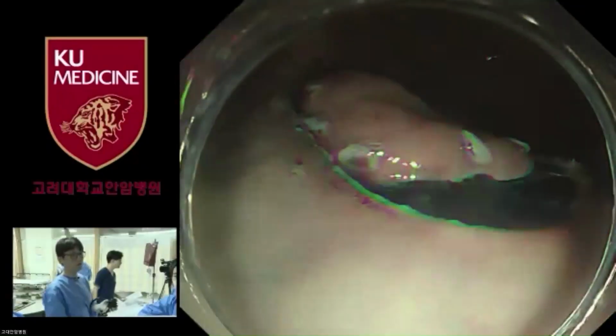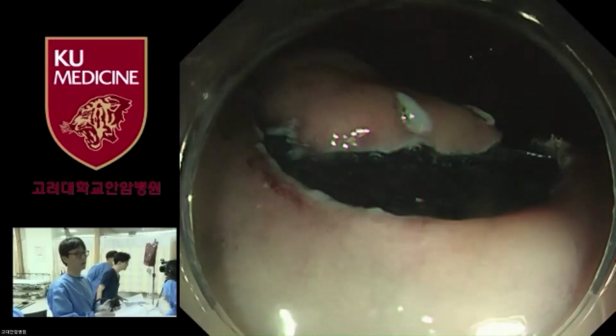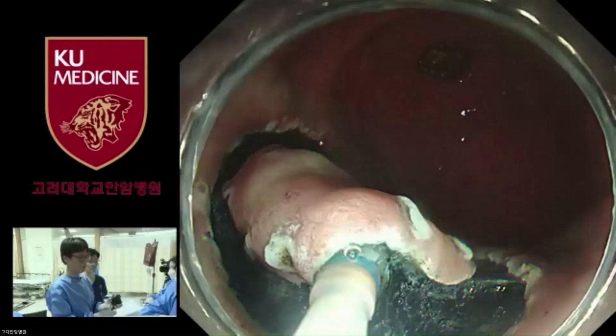Endocut I effect 2. And for Swift, what effect? You mean for the Swift coagulation? Usually for Swift coagulation we use effect 4, and the power is 50 watts. Yeah, it's the same. Ricardo as well, same setting. Erbe.